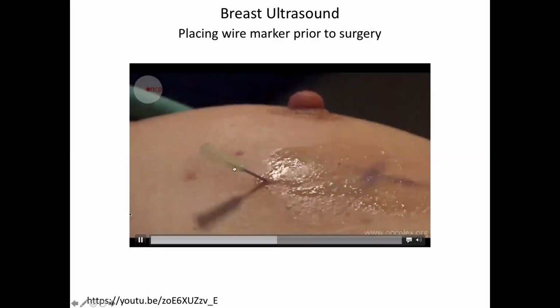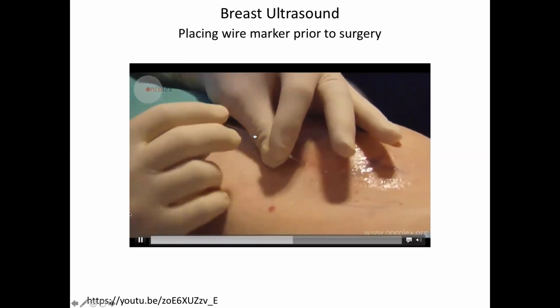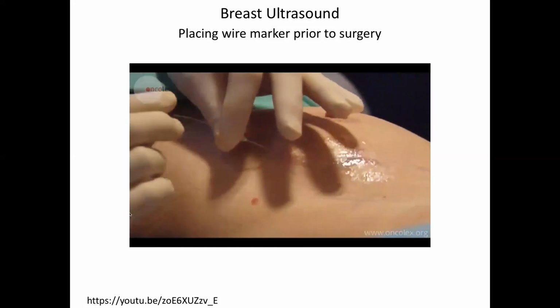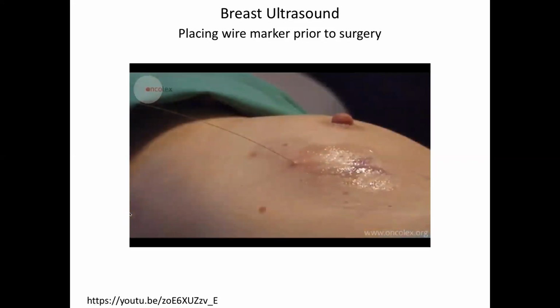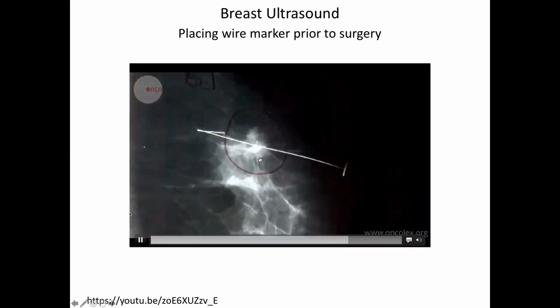And so that leaves this needle in place here, and then a wire is placed inside the shaft of the needle right to the depth that the tumor was at, and then you hold the wire and pull the needle back, and now the only thing left in there is a wire, and that wire goes right through the tumor, right? And so here it is, right?